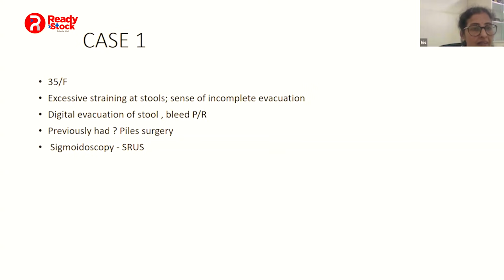When you look at a simulated defecation, you ask a patient to simulate defecation in the absence of an inflated balloon. About 30% of patients will show an abnormal response. That is not characteristic of dyssynergy. If a patient is successfully expelling a balloon with a controlled traction, then that is the gold standard for us to decide presence or absence of dyssynergy.